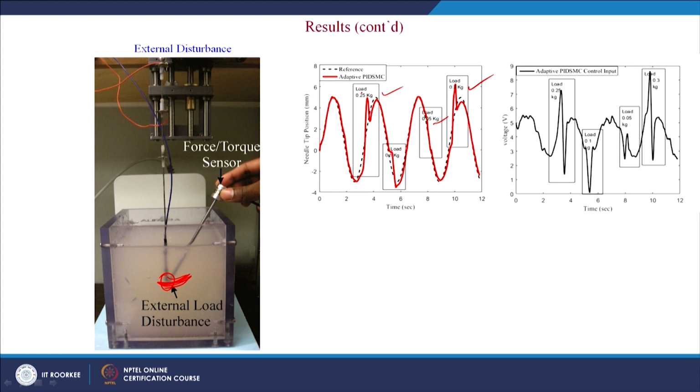Then we observed the response of this adaptive PID sliding mode controller, where the response to the disturbance during tracking is much better compared to that of the PID controller. This is the response we have observed.